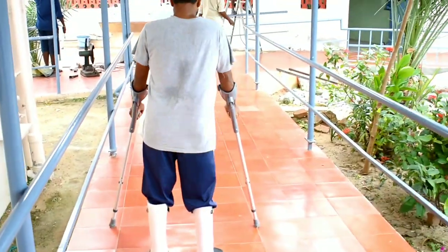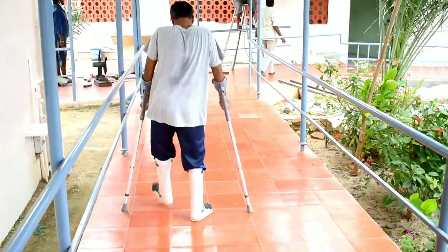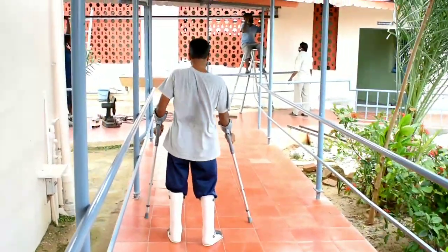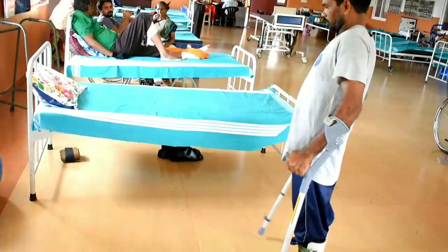This is called four-point gait with elbow crutches and AFOs. Even the weight bearing has small differences because of the muscle power changes.